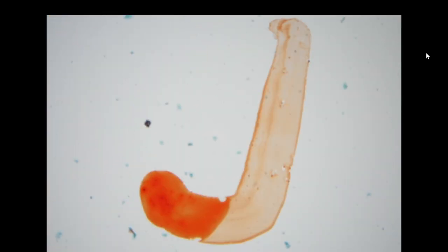The only problem is it is highly degenerated, and the number of cells is very scant. So in this situation, usually we will use the suspicious for high-grade urothelial carcinoma category. Okay, so this is the cell that we want to look for when we do urine cytology screening.